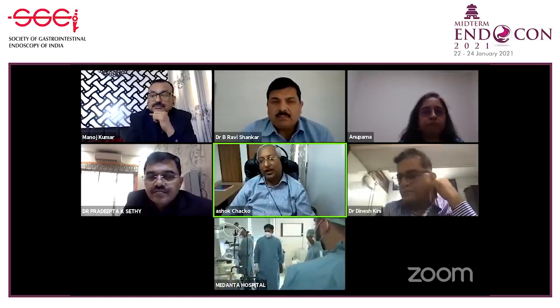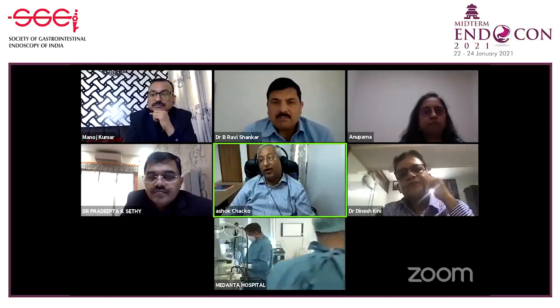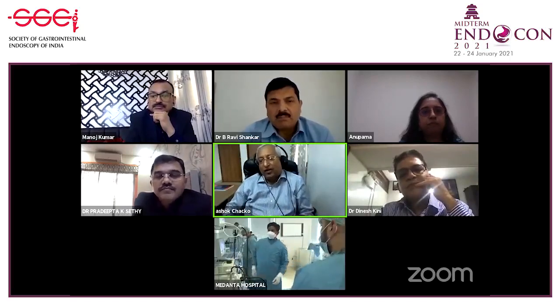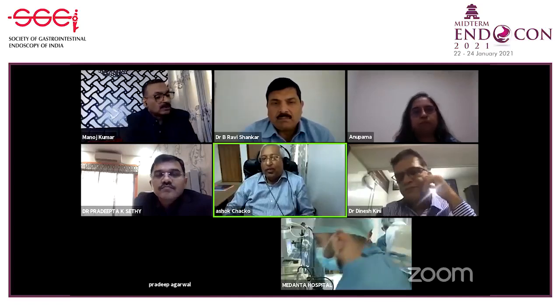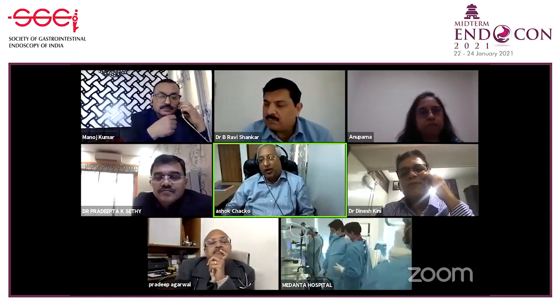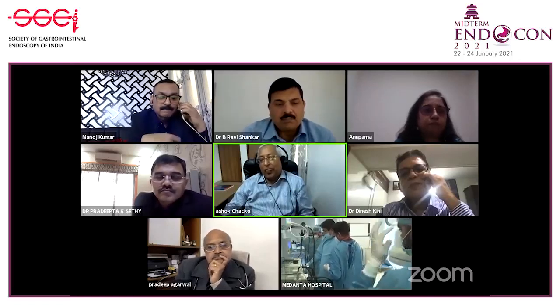An MR or CT enteroclysis is good enough to detect it if you really want to do. And sometimes if you suspect that you're going to get stuck, we may not need to do it at all. We might as well go in with other endoscopy techniques. Now that we have many other endoscopy techniques, there may not be a need for a balloon when we have a feeling that it might get stuck.